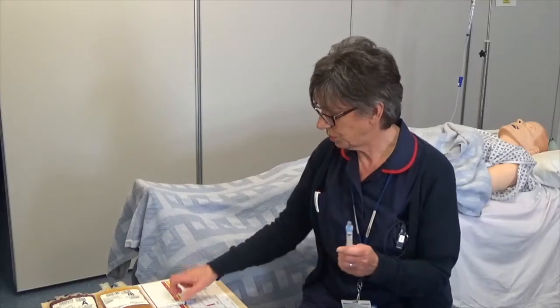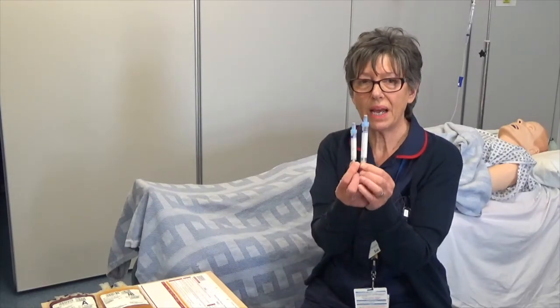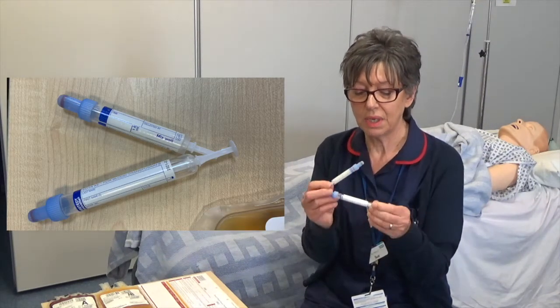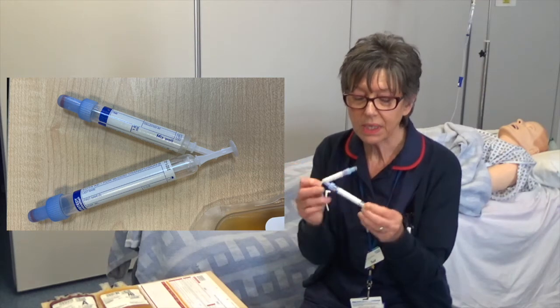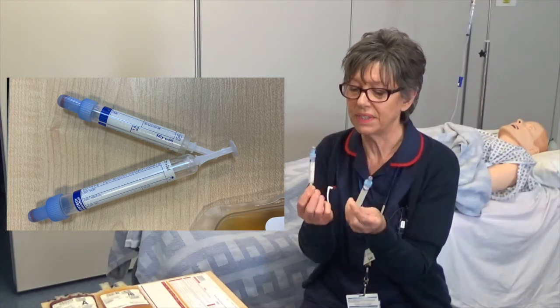These are the bottles for group and screen. These cannot have a sticker on them. They will be rejected if you put a sticker on. They have to be handwritten by the person who takes them. All the requested details are around the side here. Please make sure the bottle is in date. Again, it will be rejected if it isn't.